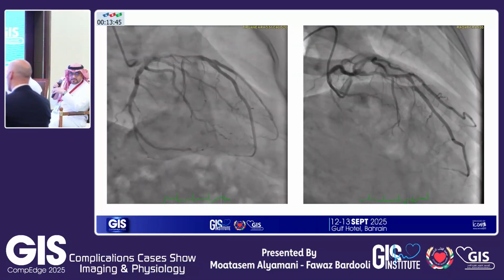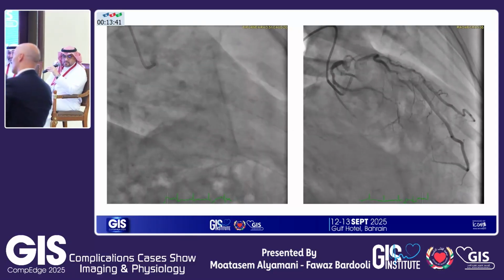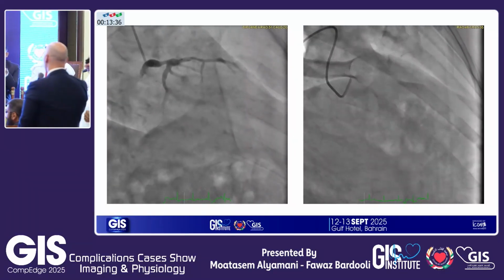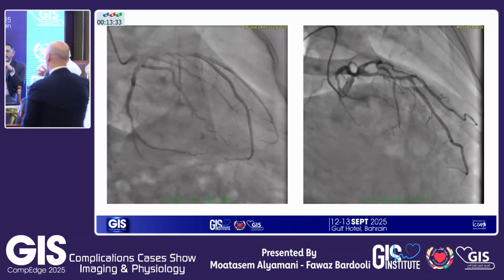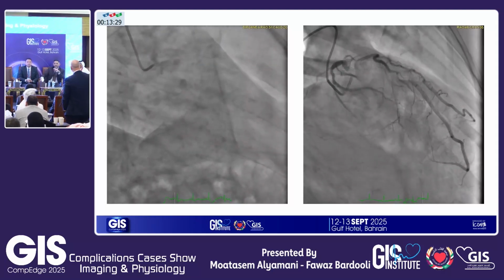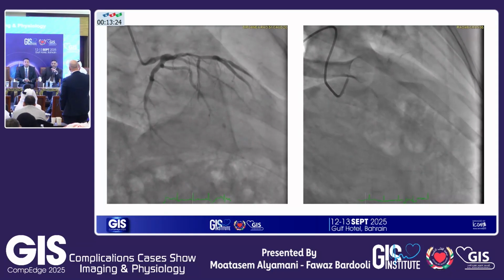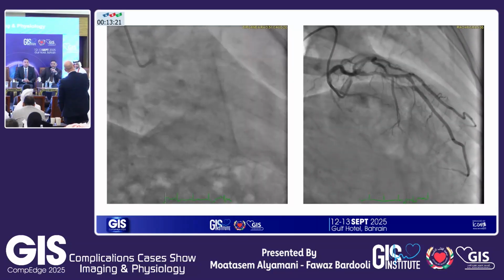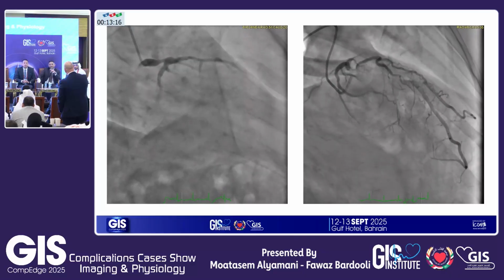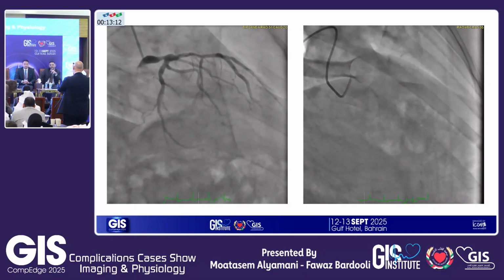So let me disagree. You will take the other way, right? And I'm going to go the other way. We're going to go with physiology, right? This is a stable patient with stable angina, not an ACS, right? And so far, there is a lesion which may or may not be significant. We don't know. Now, say you see this patient who's got a left main MLA of 7. What does that mean? Is that significant? Is it hemodynamically significant? There's data to suggest that if your physiology is normal, it's reasonable to defer this case.